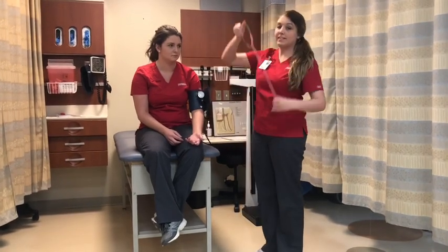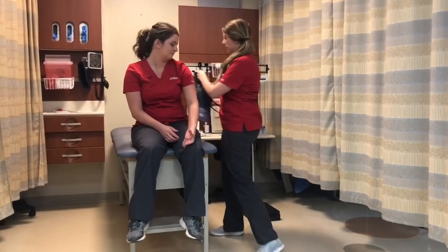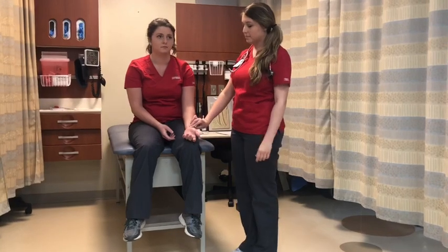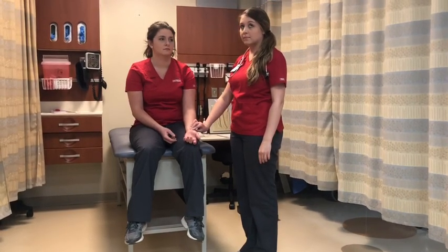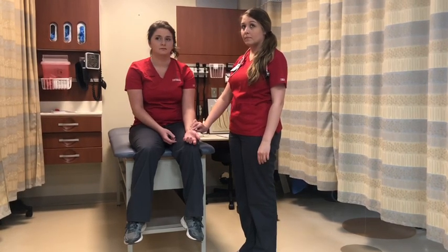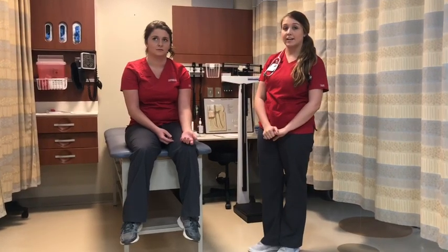Patient's blood pressure is 117/74. Now I'm going to record your pulse for one full minute. Okay, patient's pulse is 76 and respirations are 18.